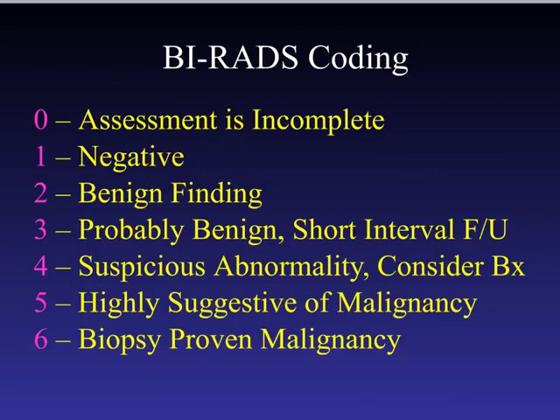We code reports as BI-RADS 6 when the patient has a recent diagnosis of cancer that has yet to be treated. And so we're saying that there is a biopsy-proven malignancy present in the breast at the current time. Again, every report that we dictate has a code assigned to it, and we are therefore telling everybody who reads our reports how worried we are about the findings that we see and what we think should happen next.